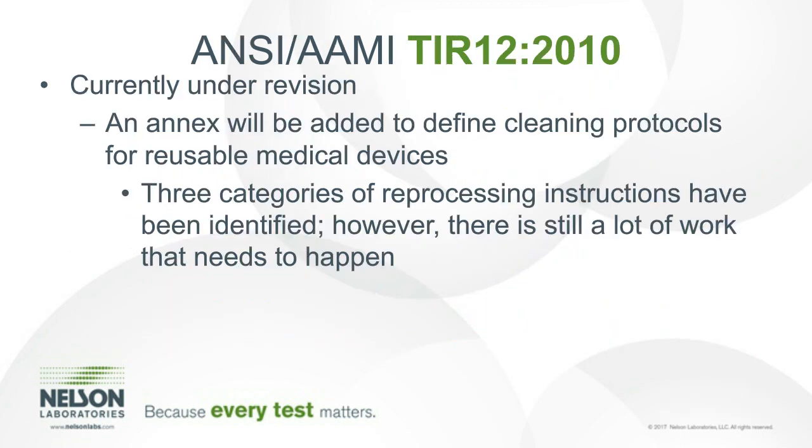Another one that is also up in revision is AAMI TIR 12. This is a compendium of process materials, test methods, and acceptance criteria for cleaning reusable medical devices. And this is currently under revision, and a lot of work has gone into the revision. Some of the things that are coming out of the standard is that there is a proposal to add an annex which will help define cleaning protocols for reusable medical devices.